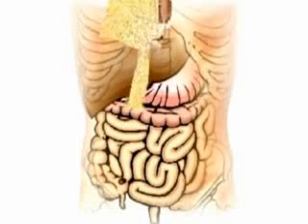The omentum is extracted through a small epigastric incision and brought out to be used to fill the sternal wound defect shown. A skin graft will be used for external coverage.